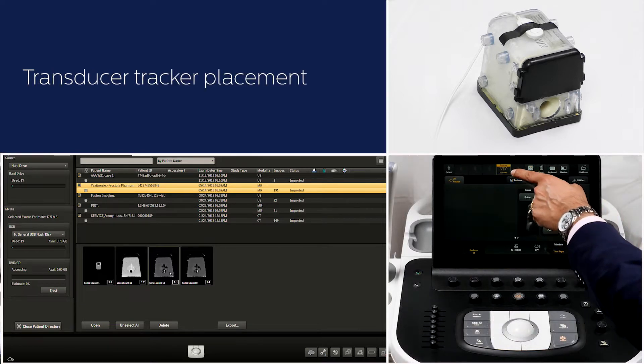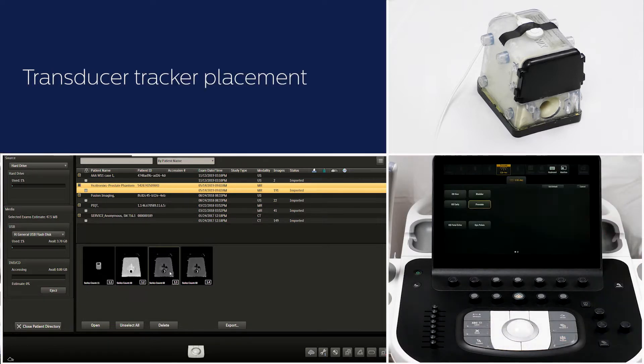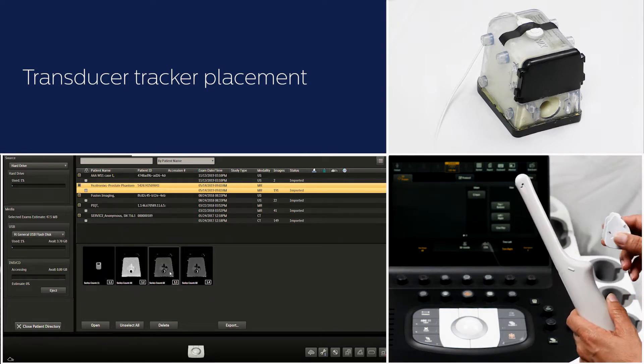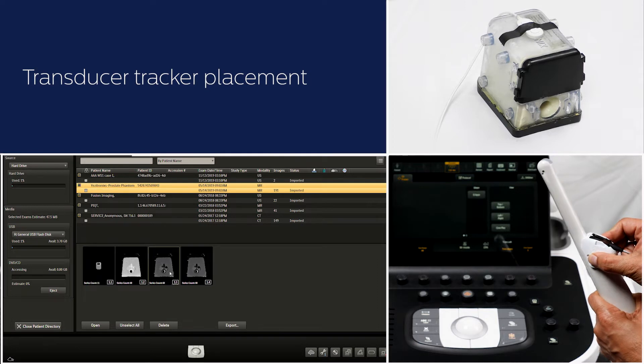Select the C10-4 endocavity transducer and prostate preset. Place the transducer tracker on the transducer. Cover the transducer and the tracker with sterile cover.